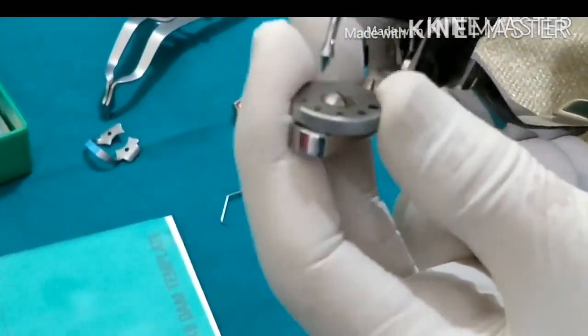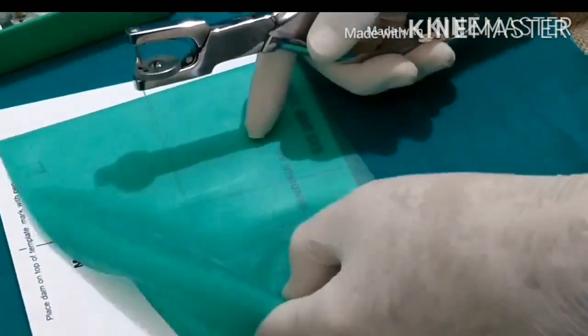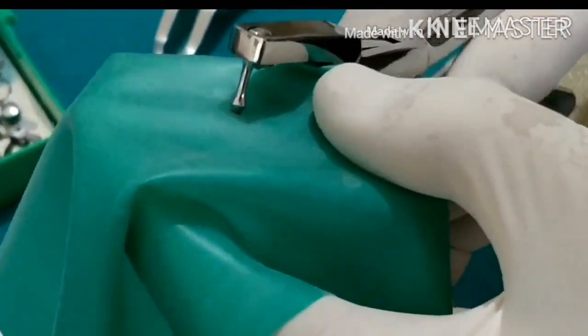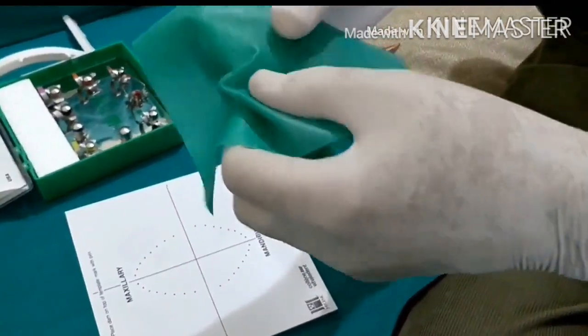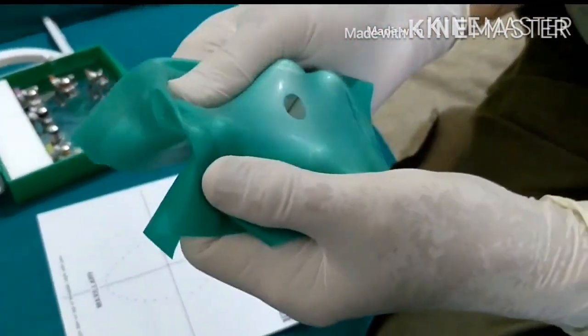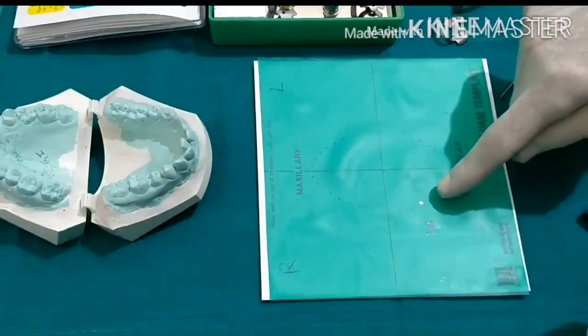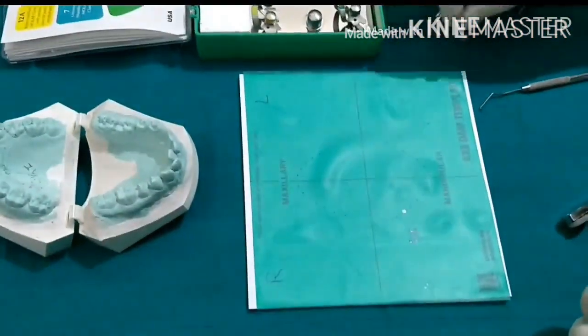We are exposing the right mandibular first molar, so the bigger holes are for molars, the next size is for premolars, and the smallest is for incisors. We select the appropriate hole, pick up our marked point on the sheet, align it over the mark, and punch. We can see it is punched. We must check that the circle is without any tear and is perfectly round — if there is a tear, you must repeat it.